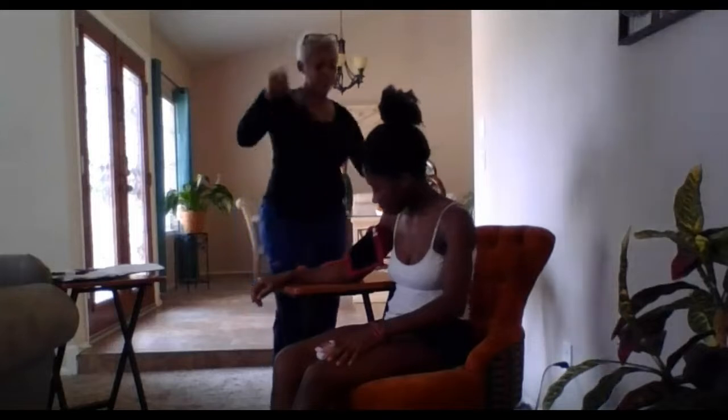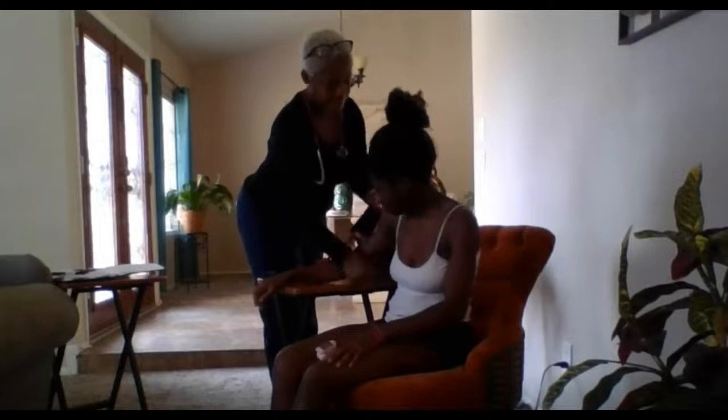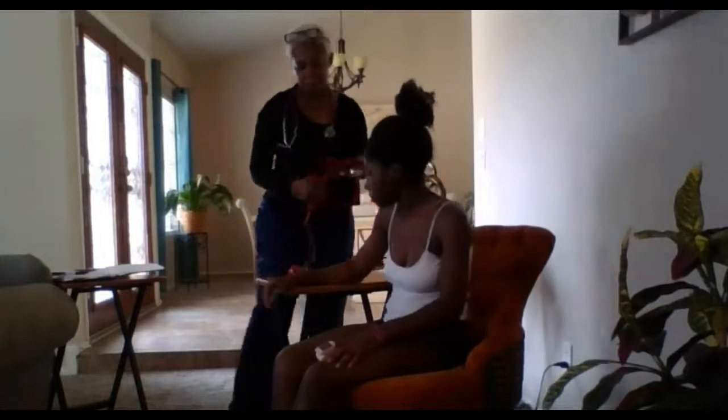Blood pressure of 110/60. Thank you. That's the blood pressure.